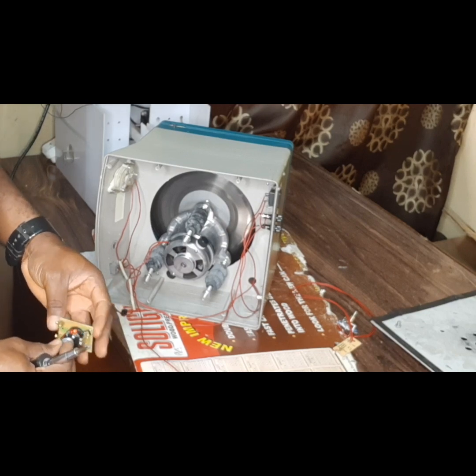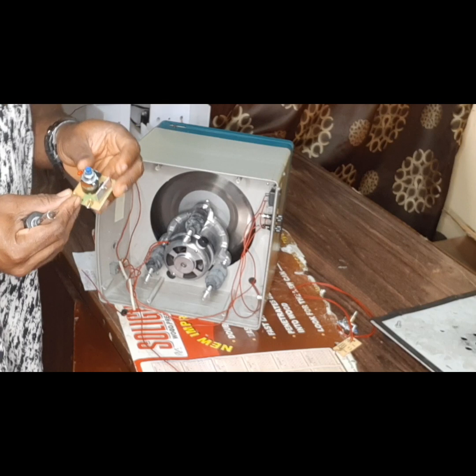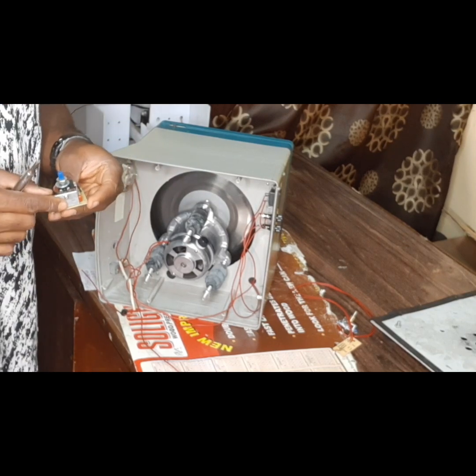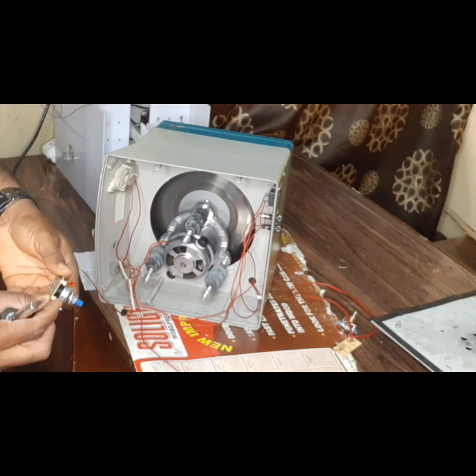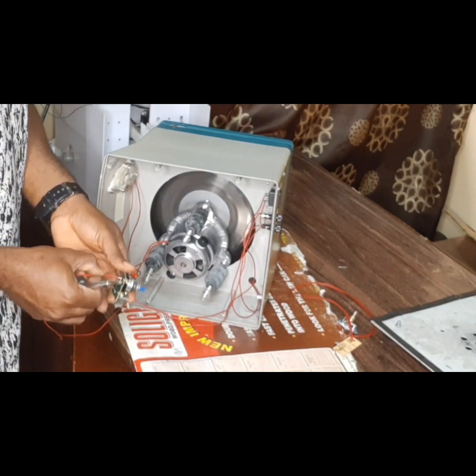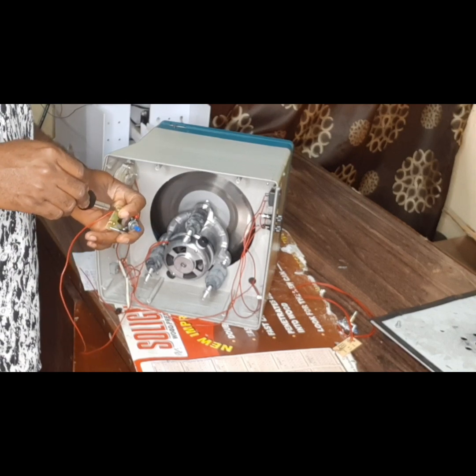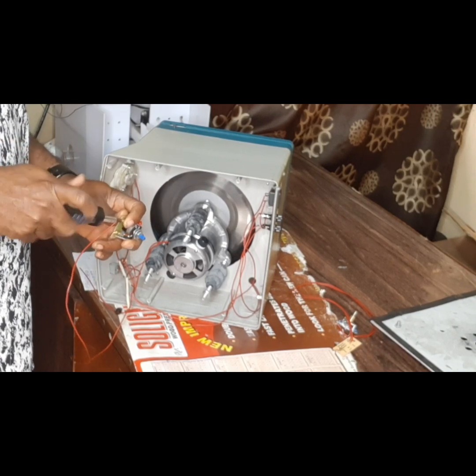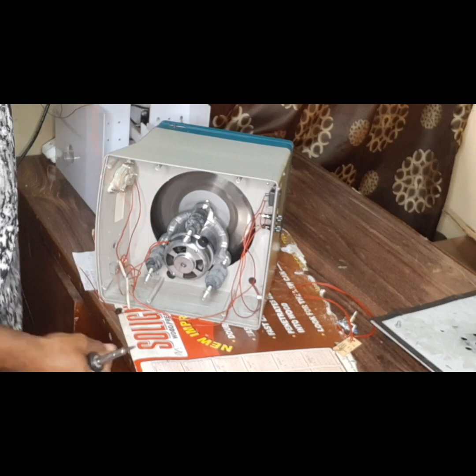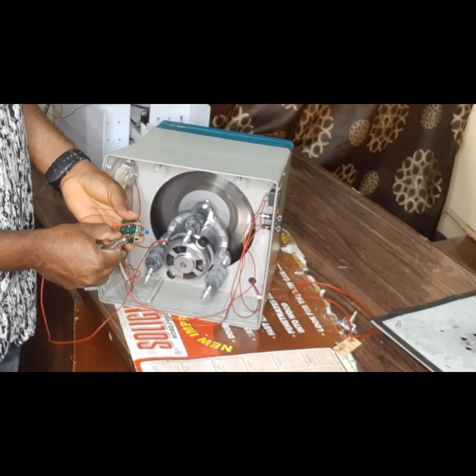The very part that is going to the potentiometer should be the input. Then the output must come from the semiconductor. So here is the semiconductor part, and this one is the potentiometer part. So I will connect one of the cords here. Hope you guys are seeing what I'm doing. I will connect one of them, then the other parts.